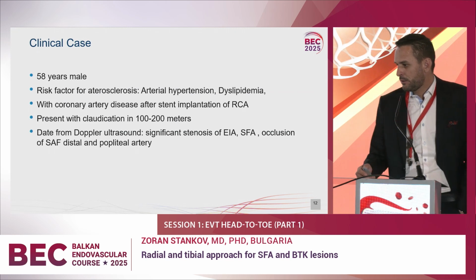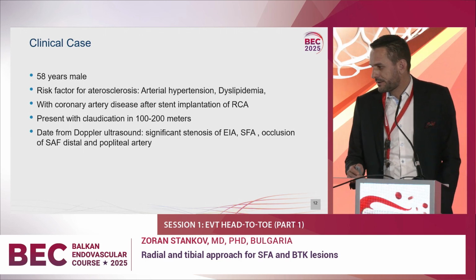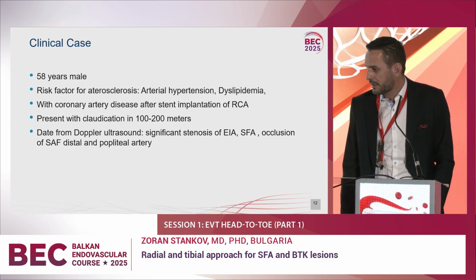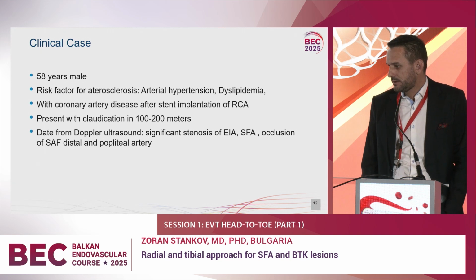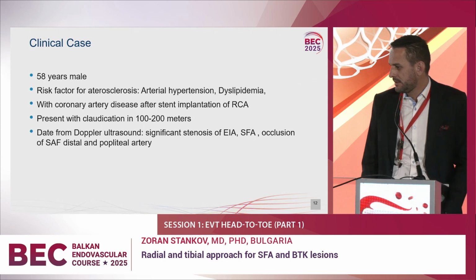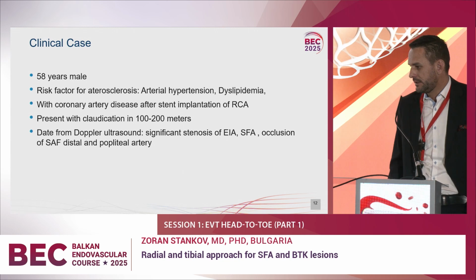Clinical case: I once showed one patient with risk factors for atherosclerosis, hypertension, dyslipidemia, with coronary artery disease after stent implantation of the right coronary artery, presenting with claudication at 100, 200 meters. Data from Doppler ultrasound: significant stenosis of the external iliac artery and SFA, occlusion of the distal part of the SFA and popliteal artery.